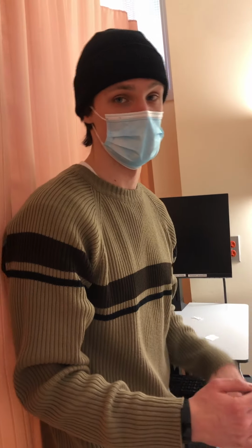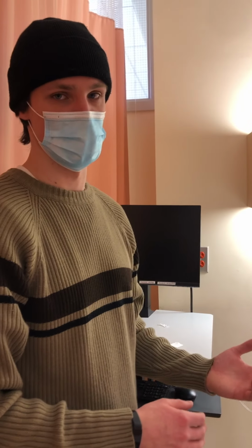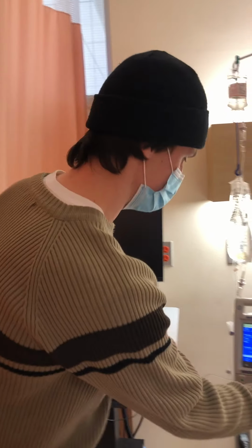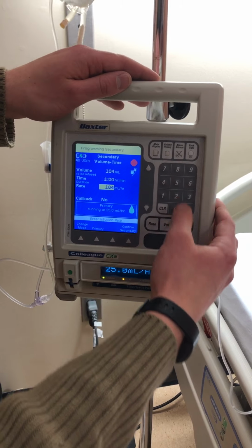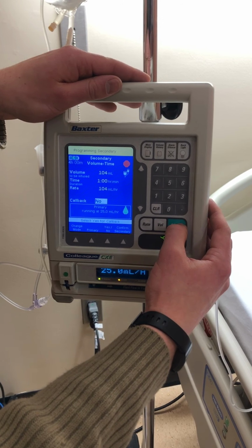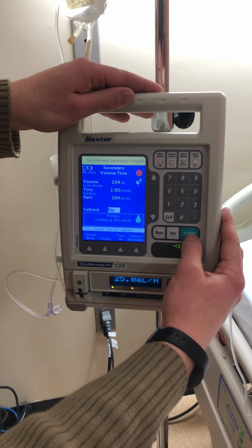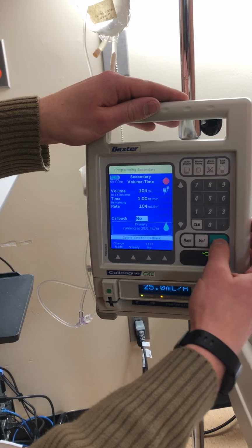I'm going to choose 60 minutes because the patient has not received this medication before, and I'm just going to monitor the reaction to their medication over time while it's being infused slowly. So 104 milliliters per hour, call back, no, and I can start, confirm, secondary, and start.